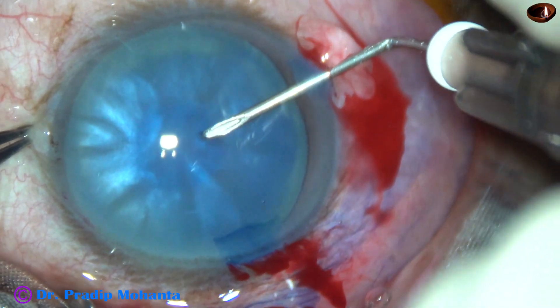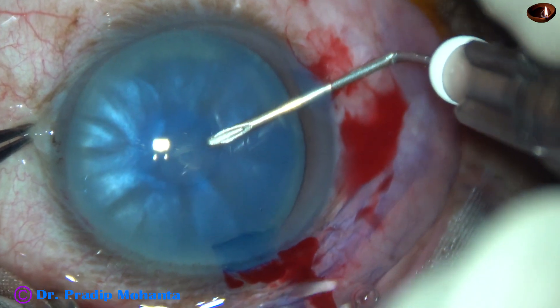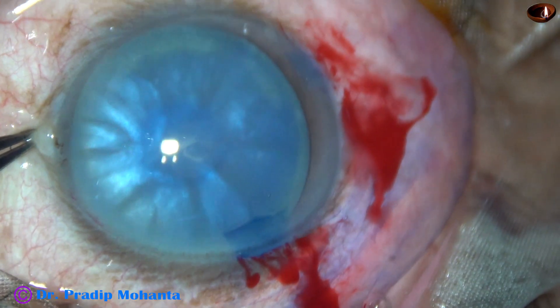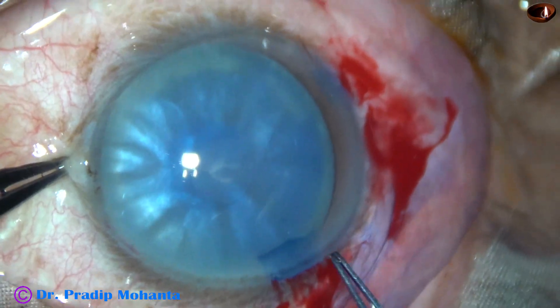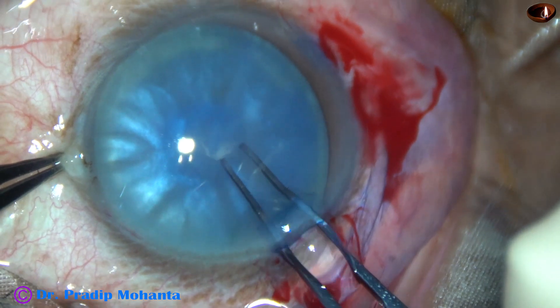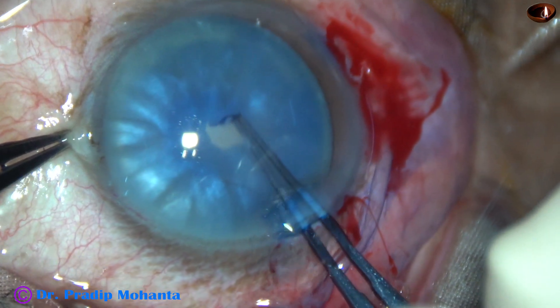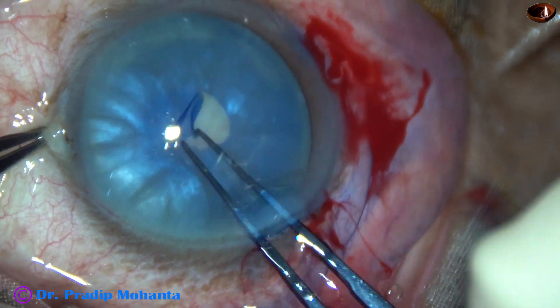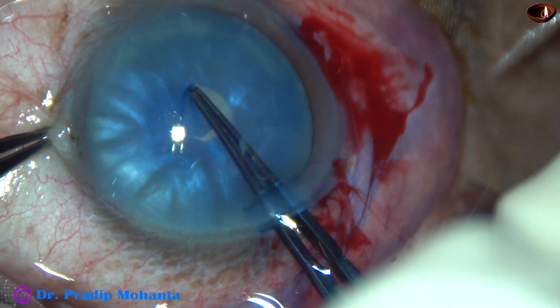The capsule is a little flat at the central part. And now, a very small C-flap has been made. A utrata forceps is being used to convert this C into a small rhexis. We can call this small rhexis a mini-rhexis.